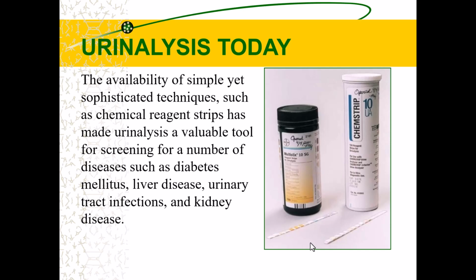You don't have to be a certified laboratorian, but it has to be hard to mess up. And the results, if you do mess it up, cannot be life or death. It can't have dire consequences if it does get messed up. Okay? So these strips are great for screening. We can look for things like liver disease, urinary tract infections, diabetes, kidney disease, other infections. There's all sorts of different things we can tell, liver issues, by reading these strips.